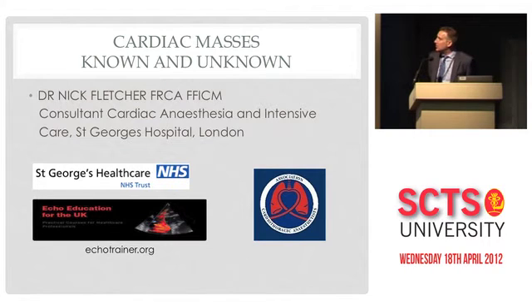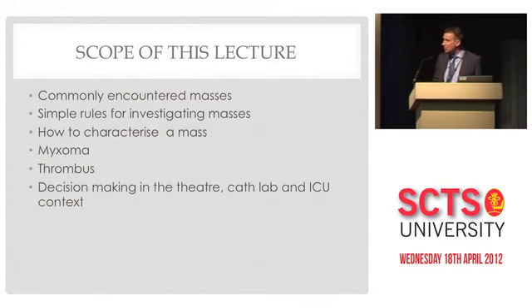So this is the lumps and bumps talk: cardiac masses known and unknown. It's not a tour de force of all the exotica and things that we don't really see. I'm going to talk about commonly encountered masses, and the simple rules for describing masses and how to characterize them.